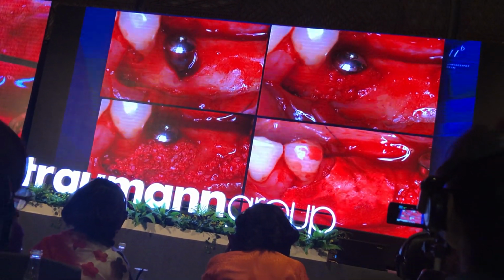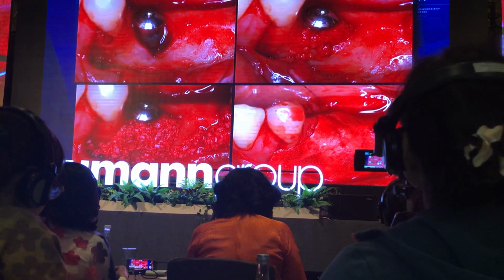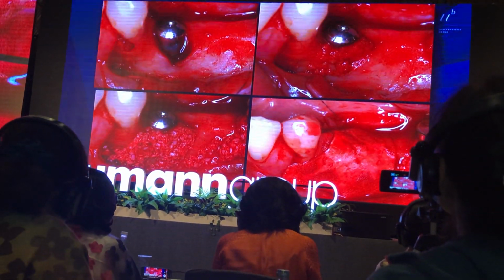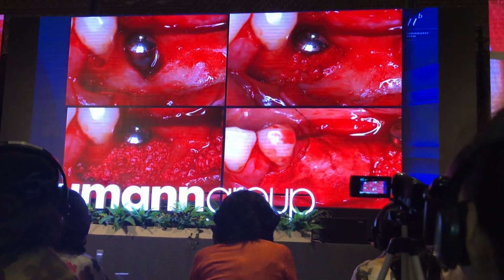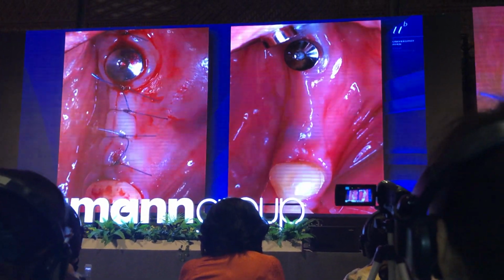When there is a certain risk to glide down, I take a fibrin sealant to stabilize. Sometimes I use tacks, 2 tacks, to stop the filler gliding down. Then the membrane and then a primary closure. Here you see the primary closure. 8 weeks later, the reopening.